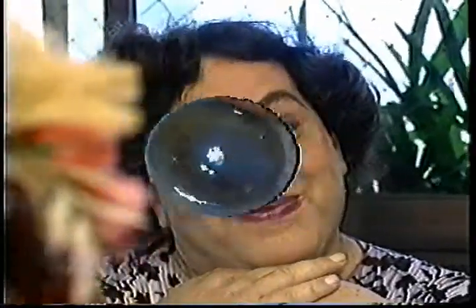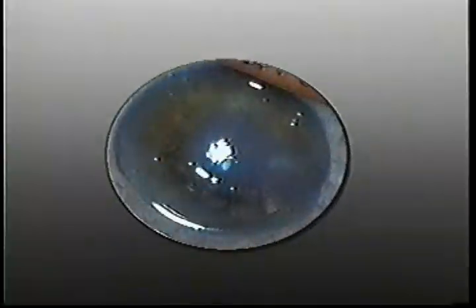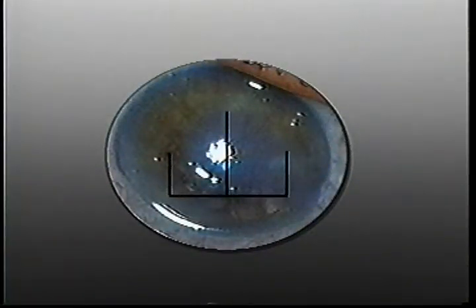That's my mother-in-law's eye. It's the same as happened to Dr. Makeley. The Descemet's membrane detached, ripped, and enrolled at the moment that I inserted an intraocular lens through a clear corneal incision. But my mother-in-law's detachment had been like that for a month, with a central bullous keratopathy.